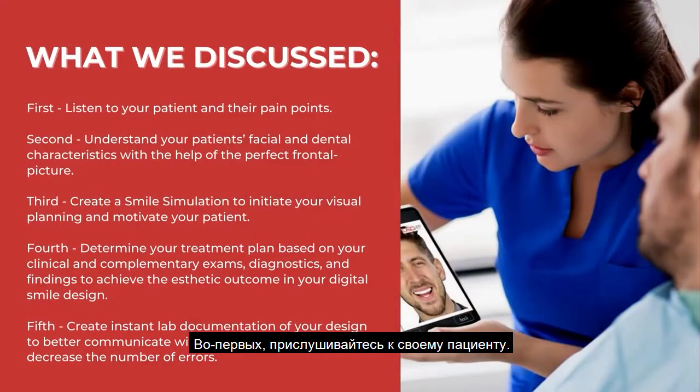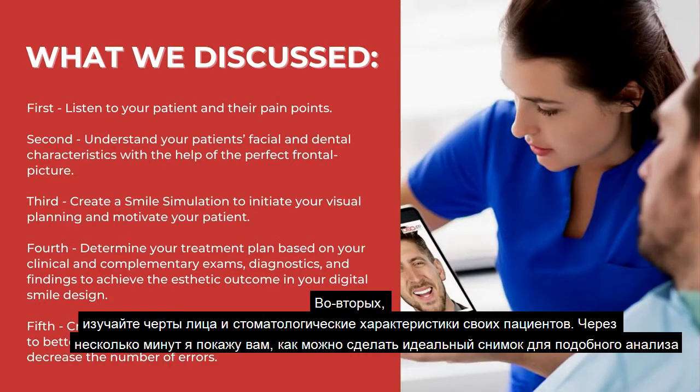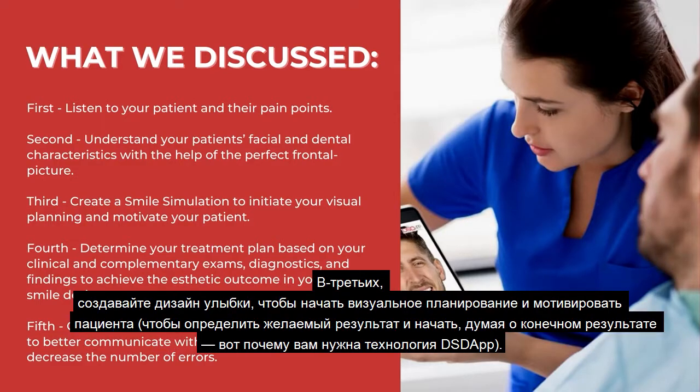So first, listen to your patient. Second, understand your patient's facial and dental characteristics. And to do so, I will show you in a few minutes how you can take the perfect picture for this analysis. Third, create a smile design to initiate your visual planning and motivate your patient to determine the desired outcome and to begin with the end result, which is why you need the DSDApp technology.